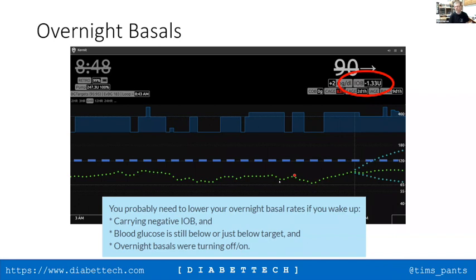There is one function in Android APS which I find useful in this, which is the blue IOB graph, where you can look back over time and see what the IOB has been overnight, not just what it is right now. Yeah, you have that in Loop too. You can visually see the IOB based on your settings and figure out some of what's happened.